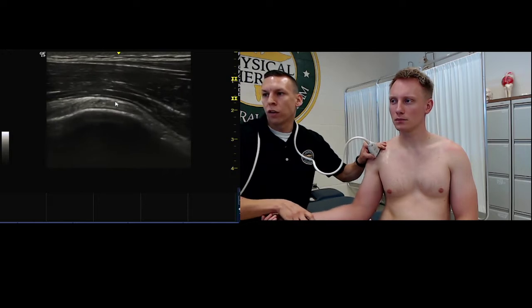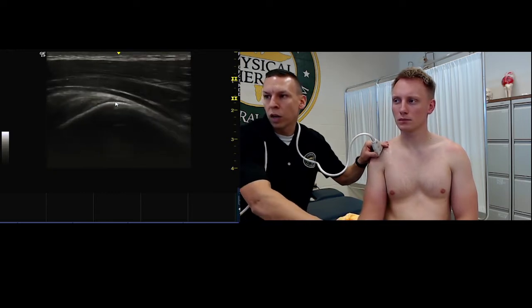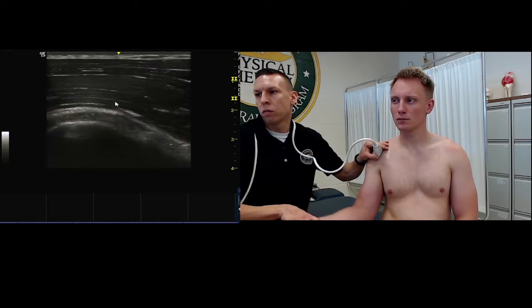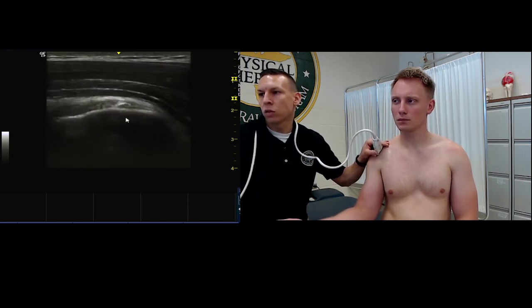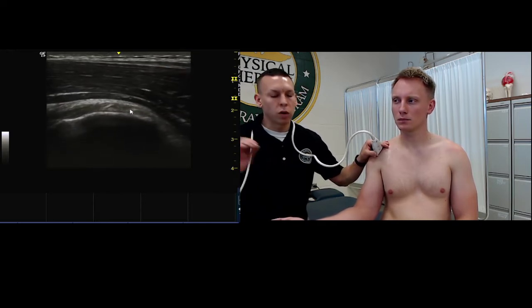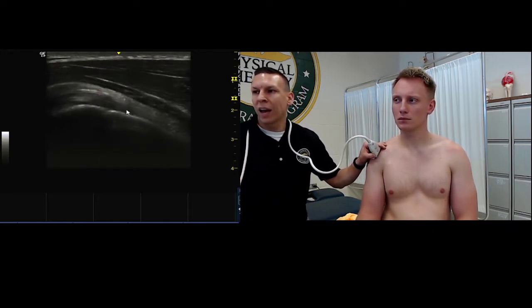And so you can visualize this moving in and out underneath your probe. You can even just have them rotate underneath you. And it has this tire on a wheel look. So here's the tire and the wheel is the humerus. And we're just looking to make sure we identify that tendon, and we're looking for any kind of abnormalities there, whether a tear, where you'll see a portion of it anechoic.